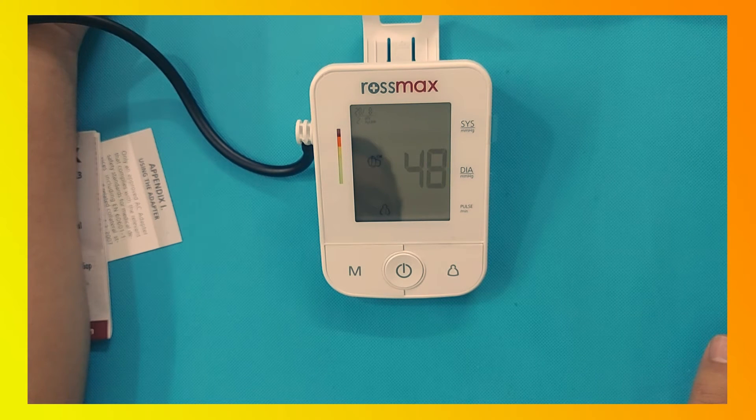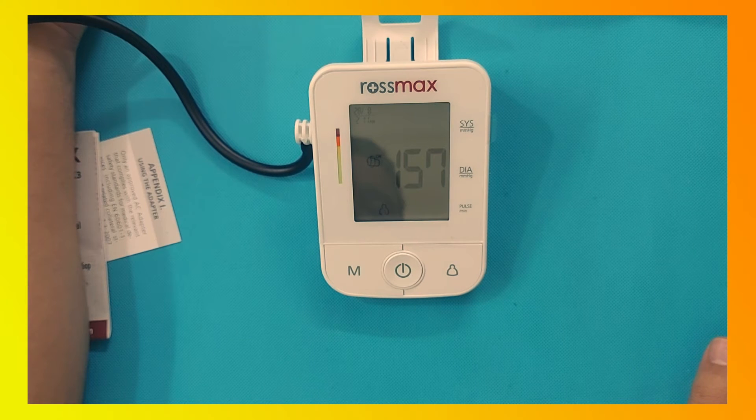The Rosemax X3 monitor starts the blood pressure measurement and will give you the result in less than a minute. It provides readings for systolic, diastolic, and heart rate. The Rosemax X3 also detects motion, so do not move your hand or body, and do not talk while taking the BP measurement.